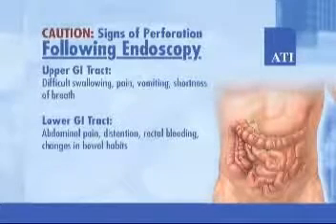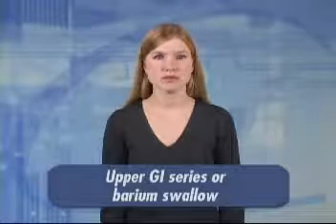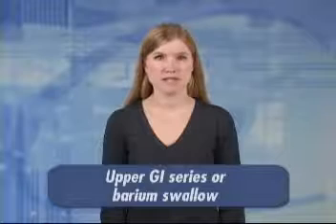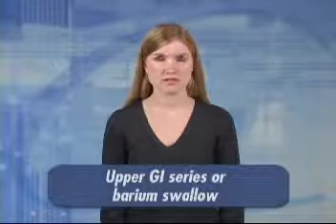Finally, there are several radiological tests that can play an important role in the diagnosis of gastrointestinal disorders. Upper GI series or barium swallow. The contrast medium is used to visualize the lower esophagus, stomach, and duodenum. It detects gastric ulcers, esophageal disorders, strictures, and tumors.